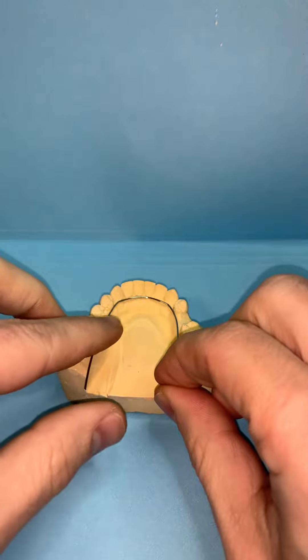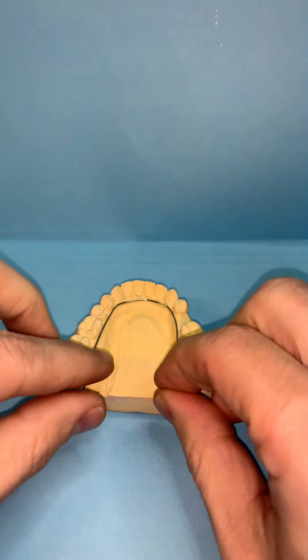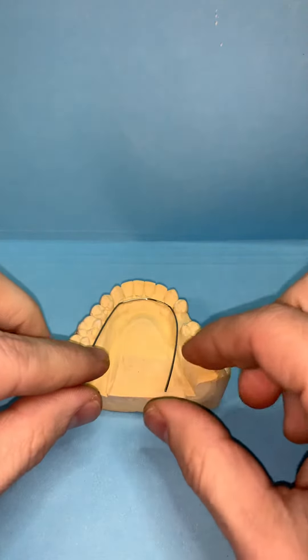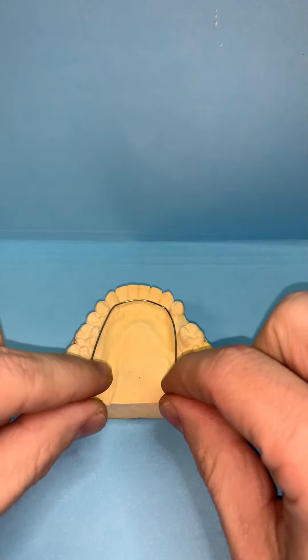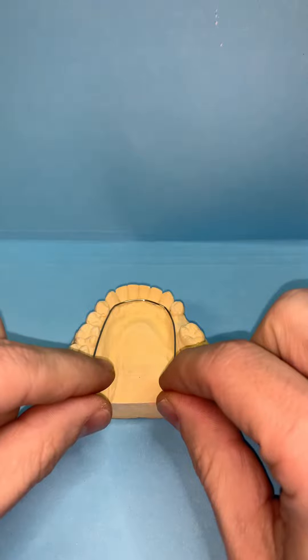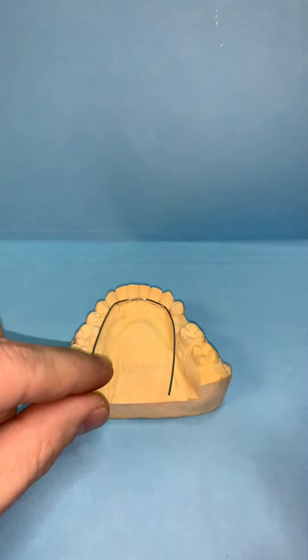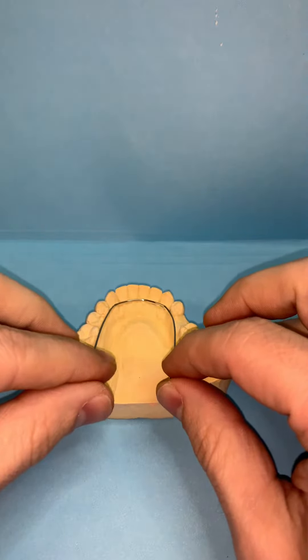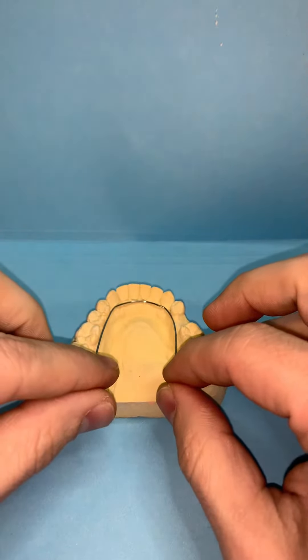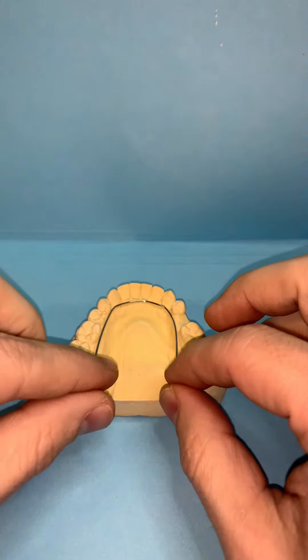And then just contour it along the lingual of the posterior teeth. You want to make sure that this contacts the cingulums of the anterior teeth because if you have any pressure from the distal, it's not going to push the teeth out of position. The tooth is very anchored in at the cingulum.